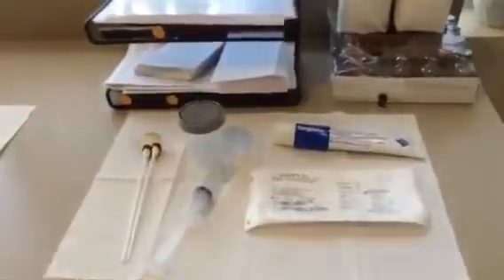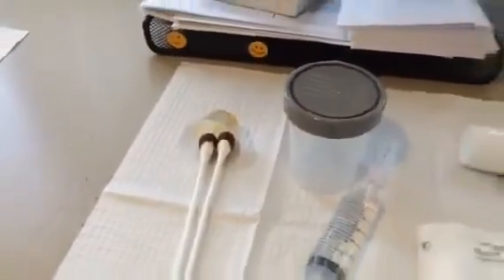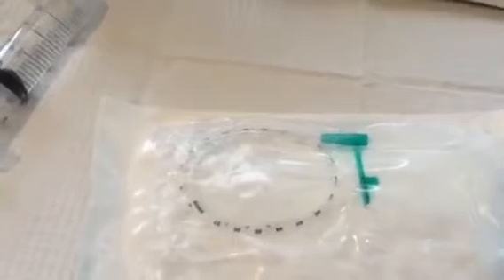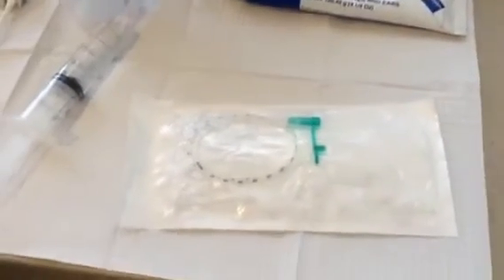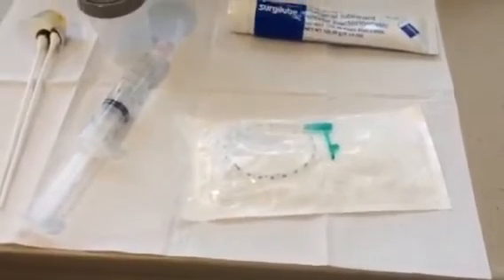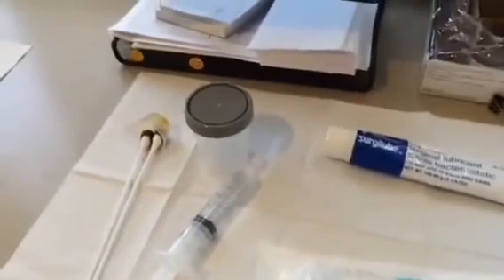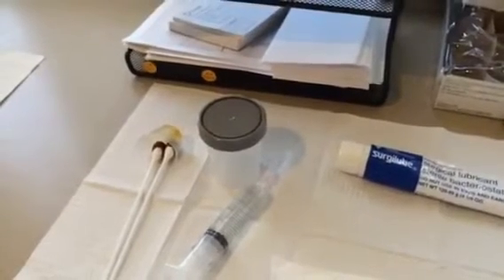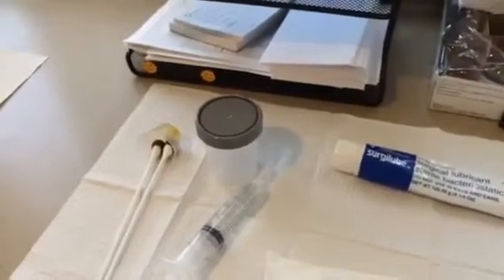We've got the bladder instillation solution. We simply wipe the urethra with a little bit of iodine on some swabs. We have a urine cup, and we usually use 8 French pediatric feeding tubes — you can see the label here, this is what they look like. We use a little bit of sterile lubricant on the tip of the catheter when it's inserted into the urethra.